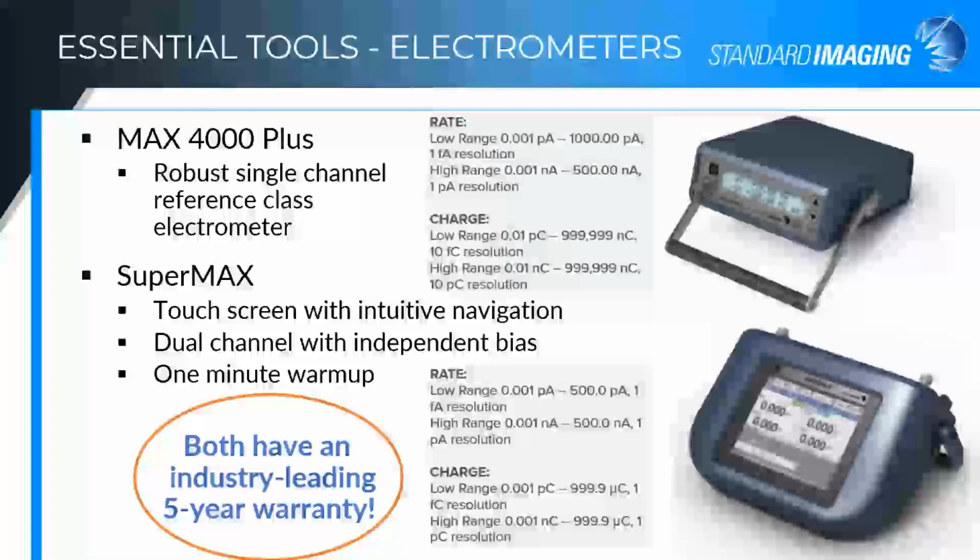Well, you definitely want a high quality electrometer. You want one that's stable and one that's calibratable, really, so that you can get high quality measurements over and over throughout the lifetime of your electrometer. It's important with these small field measurements to make sure that you're matching the range and capabilities of the electrometer with the magnitude of the signal that your detector will generate.